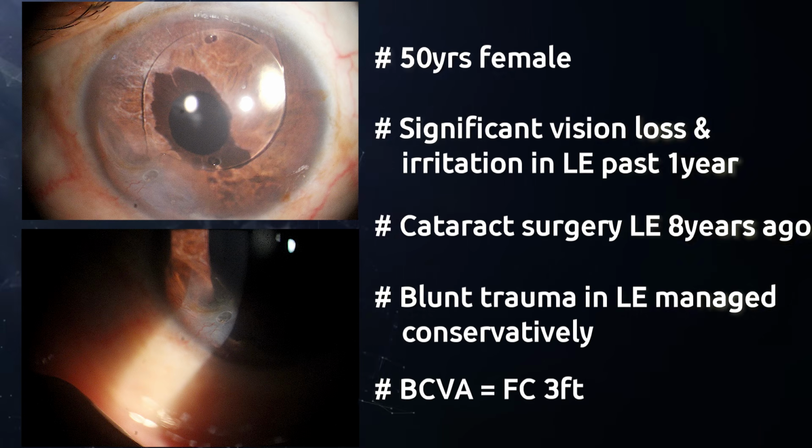On slit lamp examination, the optic of the IOL was seen forwardly dislocated, resting over the pupil, with incomplete view and orientation of the haptics. There is pupillary ectropion uvea and iris pigmentary changes. Cornea has few epithelial bullae with localized stromal edema around the inferonasal area.